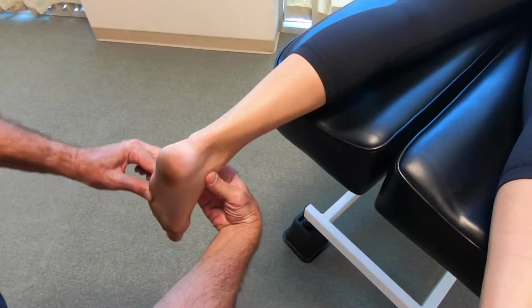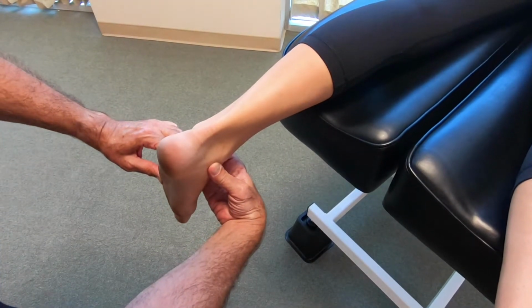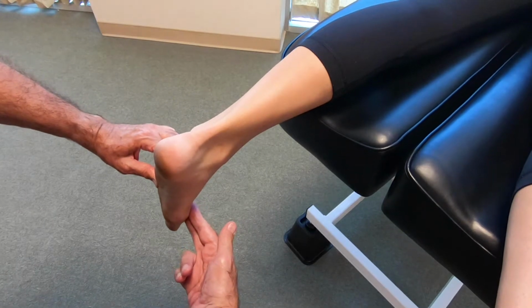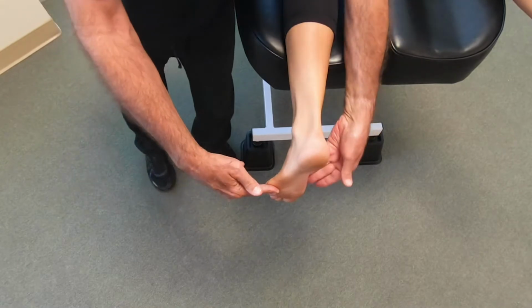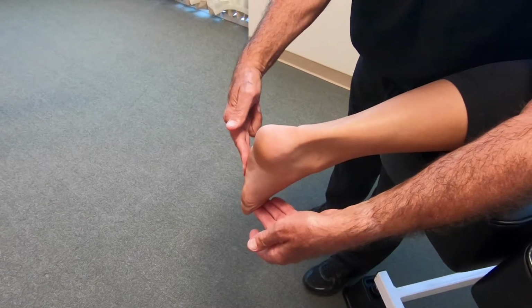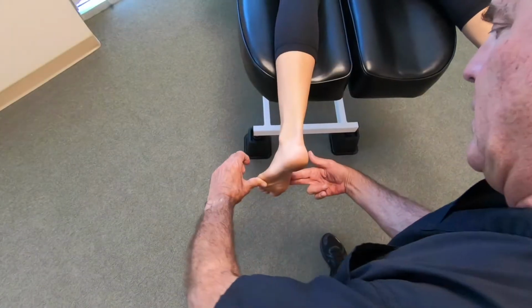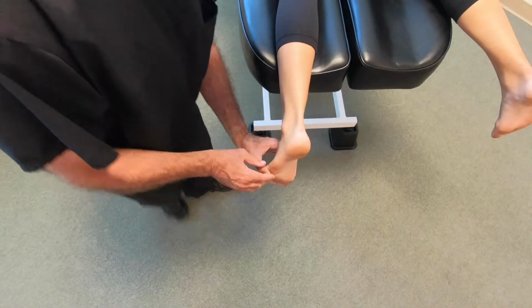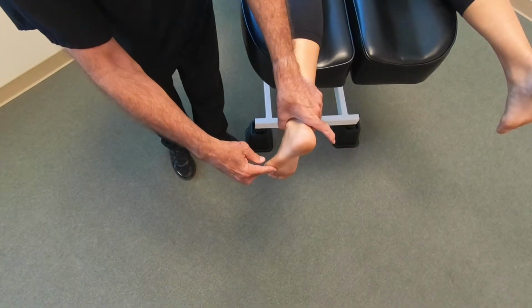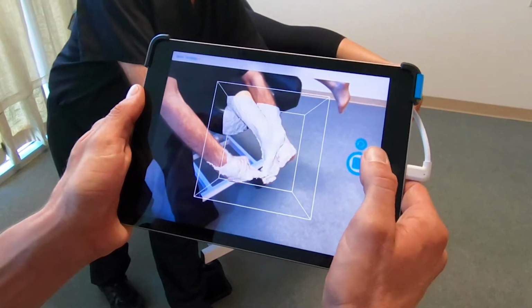With palpation, the subtalar joint is placed in a neutral position, and the forefoot is maximally pronated on the rear foot with pressure upwards against metatarsal heads 4 and 5. The first ray is gently plantar flexed to further pronate the forefoot and reduce supination deformity. The practitioner must step around the foot and now recreate this corrected position in order for the scan to be taken.